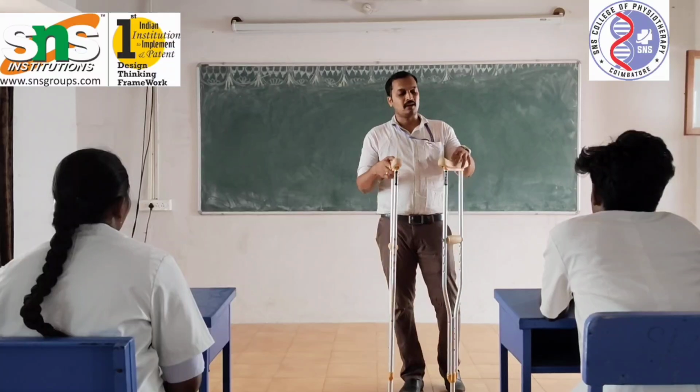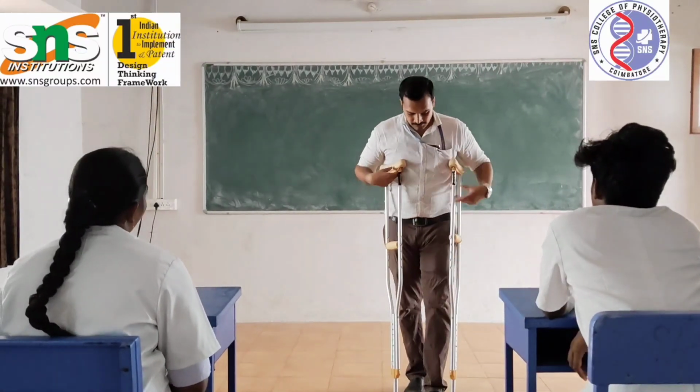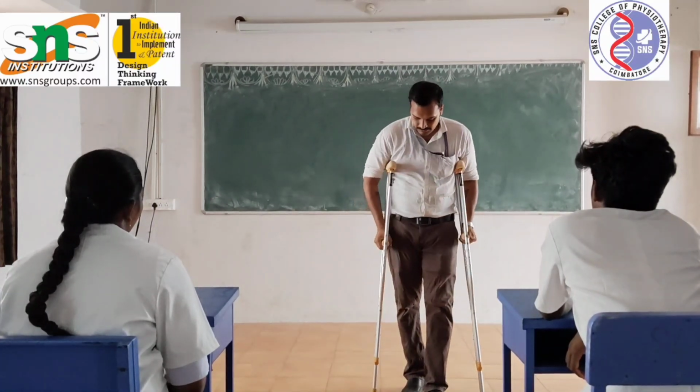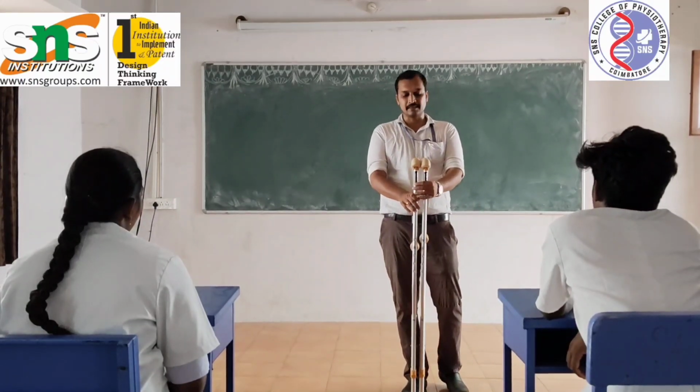Why is it called the axillary crutch? Because we take support of the crutch at the axillary level. So this is called the axilla. We use this crutch at the axillary level, so this type of crutch is called the axillary crutch.